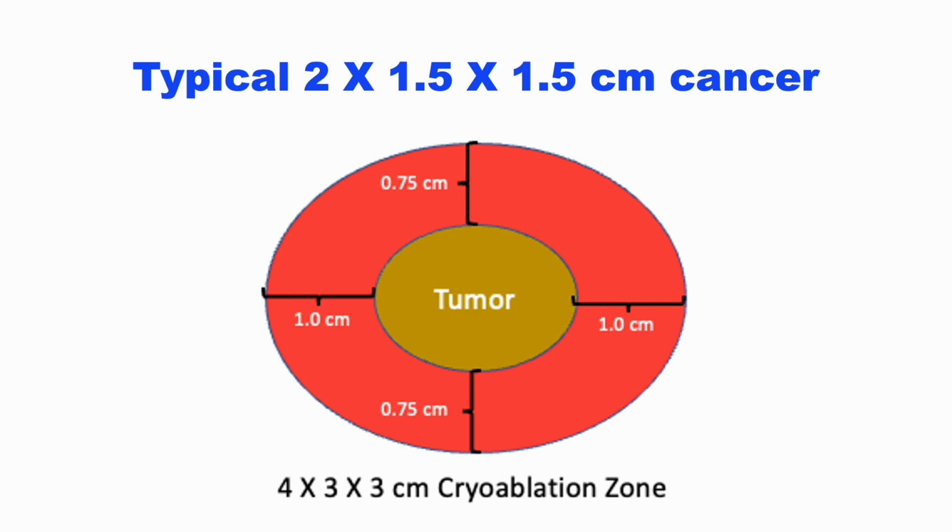The design of the current system, the tools that we use, the cryoprobe, is optimized for treating tumors 2 centimeters or smaller. But even if we wanted to treat a larger tumor with a single cryoablation treatment, we're limited by the fact that we can't create a larger ice ball, because the body tends to warm the breast, or the body tends to compete against the ice that is forming in the breast. And in this competition, the warming of the site by the normal body temperature is what limits the ablation volume of a single ablation.